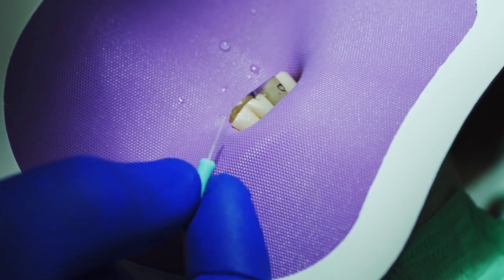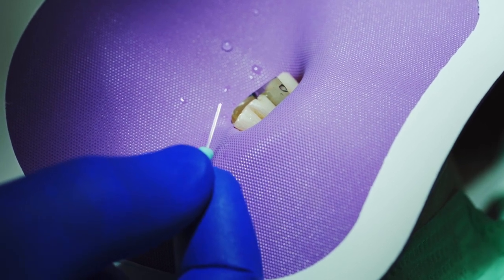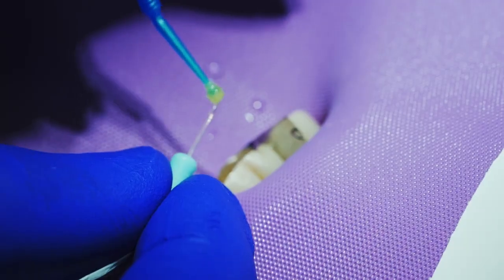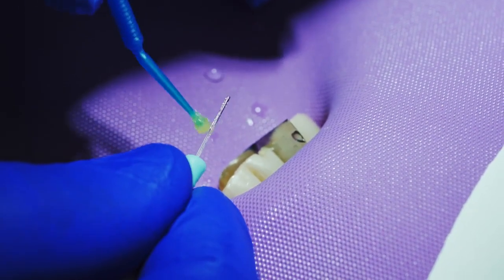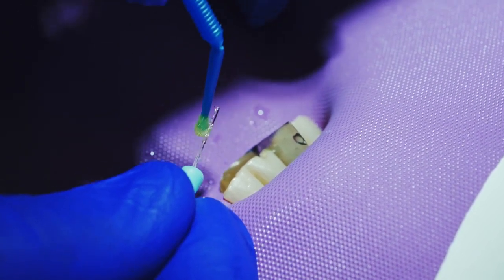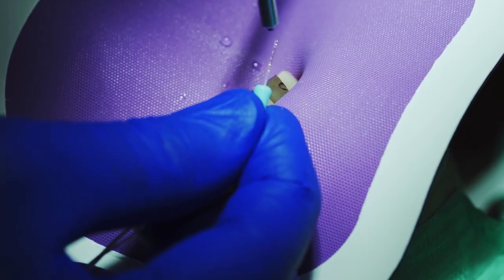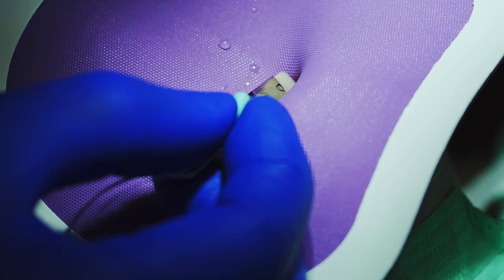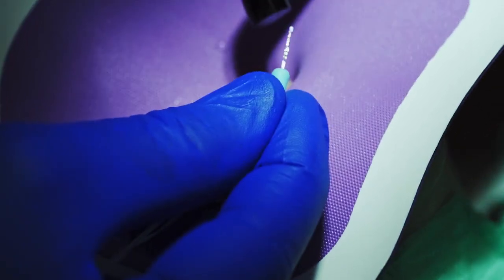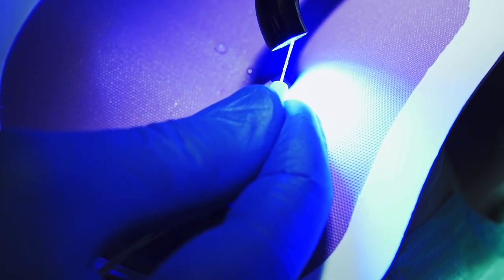It is prepared, and as I stated earlier, it will accept any bonding agents or glues that you may have in your office. So we'll prime and bond. There's a handle — we always encourage you to make sure that you have floss inserted on the handle. I've inserted these with just the prime and bond, but I also like to use flowable composite to anchor it into the tooth, so we'll use that with this technique.